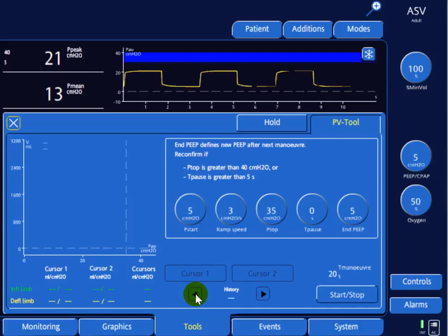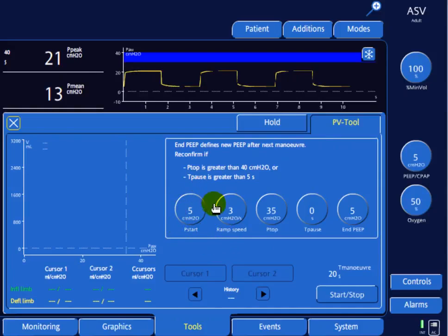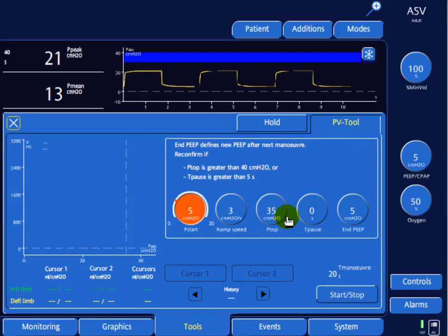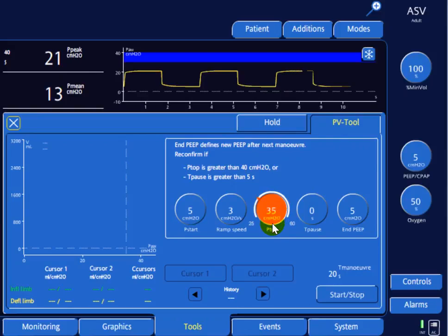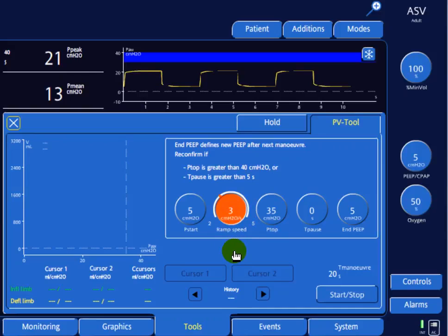Once you click OK you enter this window, where you can give one breath. You can define the starting pressure, which is the starting PEEP — let's set it to 5. We're going to go from a PEEP of 5 all the way to the top pressure, which is the peak inspiratory pressure of 35, at a ramp speed of 3 centimeters of water per second.